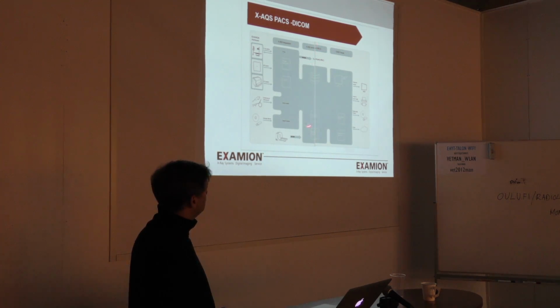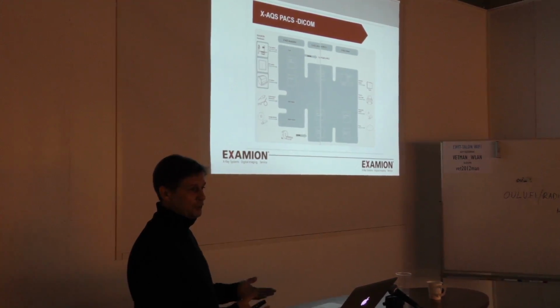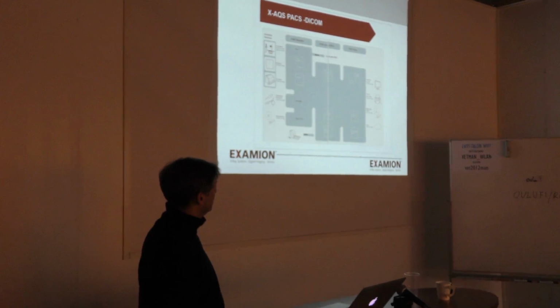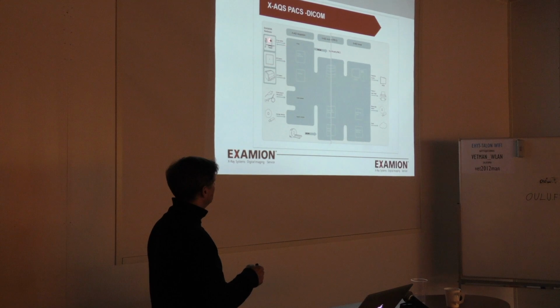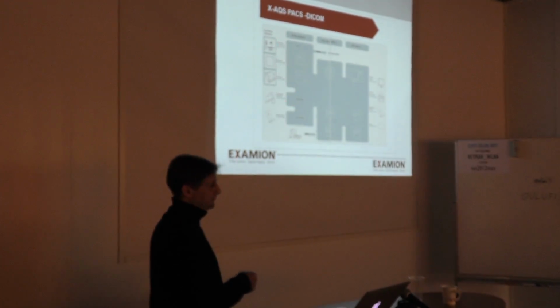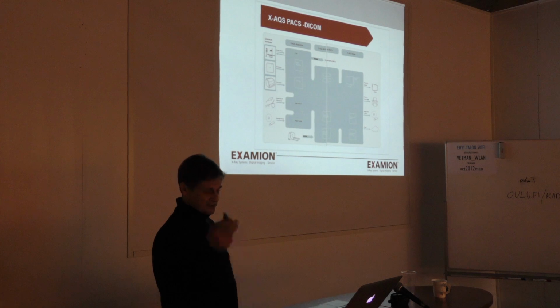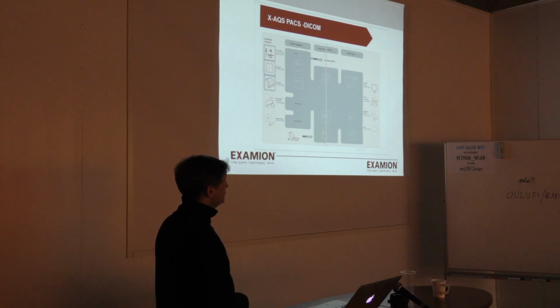So these are like 3 blocks, and you can have them all together or separately, but they can all be added. This is very important. In practice, in the veterinary clinic, if you get your administration data in and you have the devices in your clinic all sending the DICOM images, and they are put in an archive and then sent throughout where you want them, this is the most interesting.